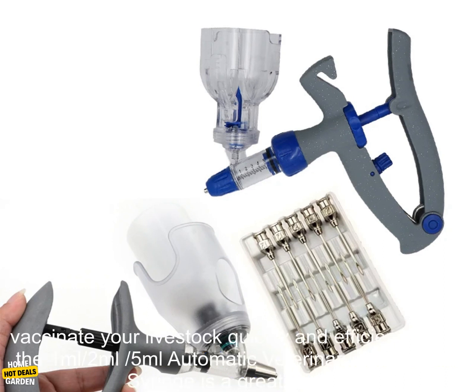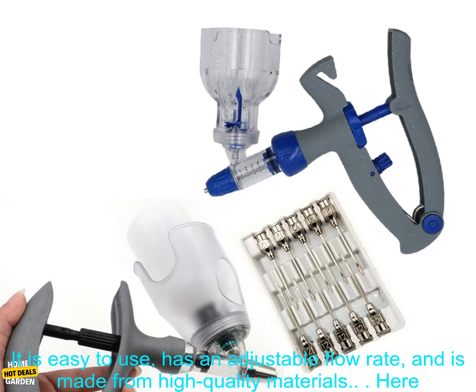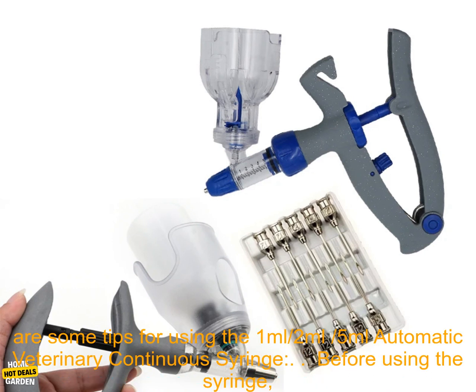If you are looking for a way to vaccinate your livestock quickly and efficiently, then the 1 milliliter, 2 milliliters, 5 milliliters automatic veterinary continuous syringe is a great option. It is easy to use, has an adjustable flow rate, and is made from high quality materials.